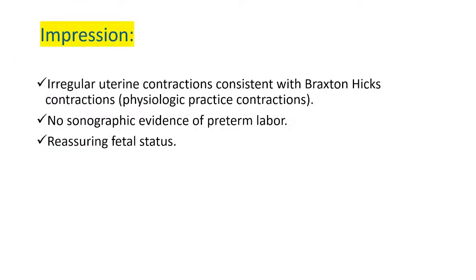Okay. The impression now that we have: irregular uterine contractions consistent with Braxton Hicks contractions, physiological practice contractions. So this is very important. You must know that the Braxton Hicks contractions are physiological practice contractions. They are not pathological. No sonographic evidence of preterm labor, reassuring fetal status.